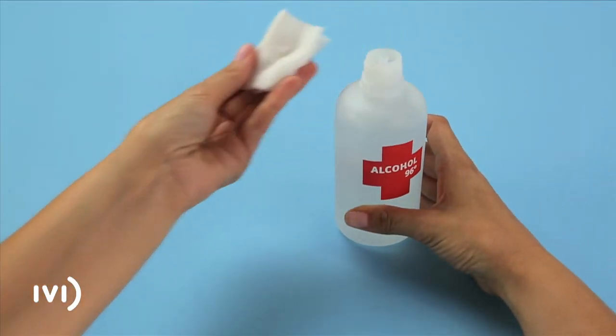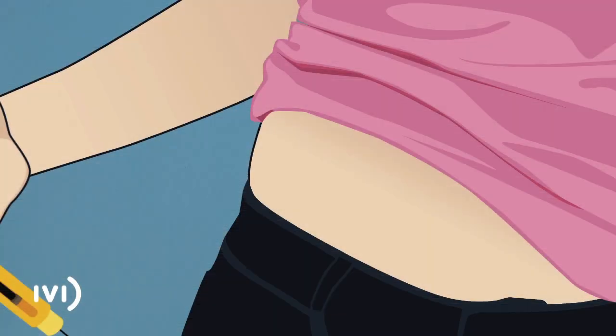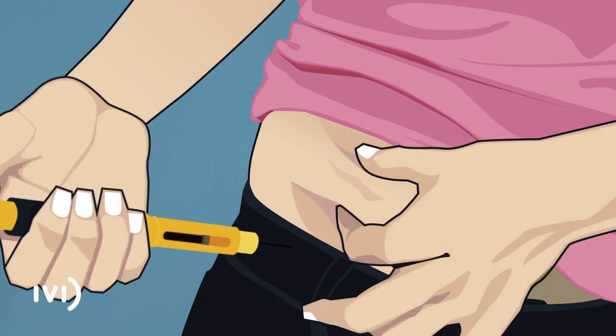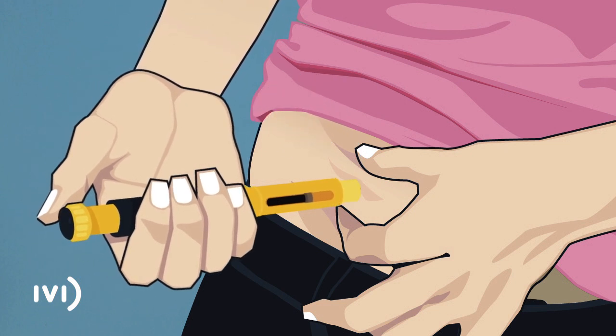Take some gauze soaked in alcohol and thoroughly clean an area of your abdomen below the level of your navel. With one hand, pinch a fold of skin and insert the entire length of the needle, with the bevel pointing up, at an angle of 45 to 90 degrees, holding the blue part of the pen.